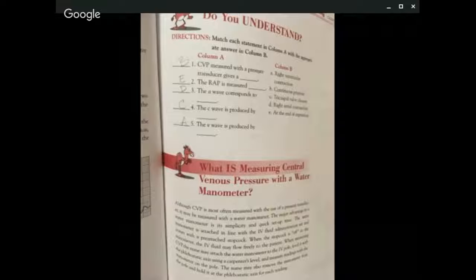The nurse may attach the water manometer to the IV pole, level it with the phlebostatic axis using a carpenter's level or a meter stick, and measure readings with the manometer on the pole. The nurse may also remove the manometer from the pole and hold it at the phlebostatic axis for each reading.